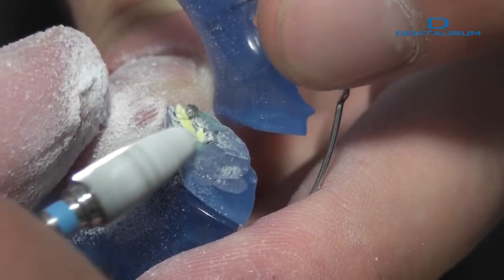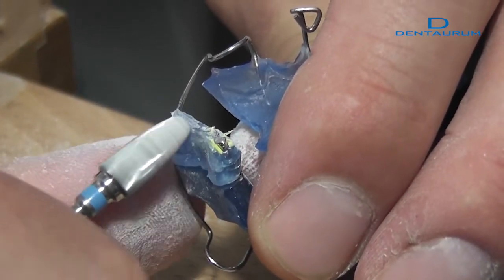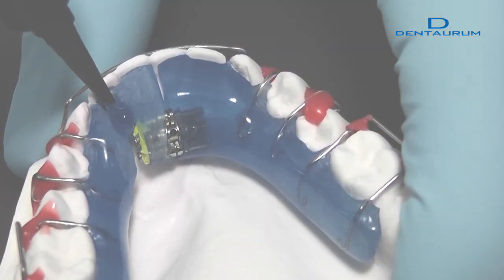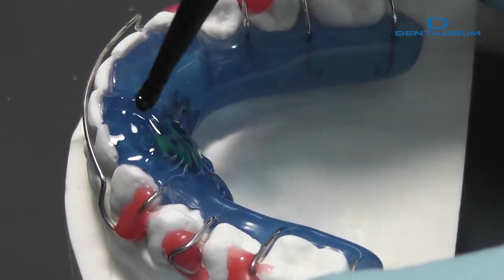Appliances made with OrthoKryl LC can be repaired using OrthoKryl LC. Roughen the area concerned and remove any grinding dust. The material can then be applied directly, and the repaired appliance is then cured in the light curing unit.